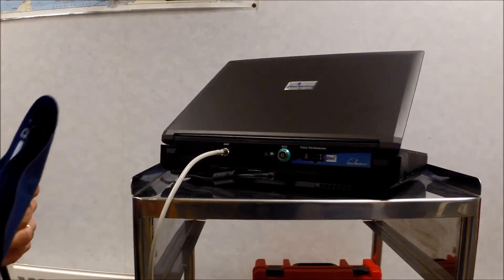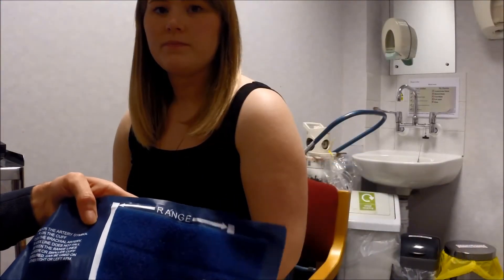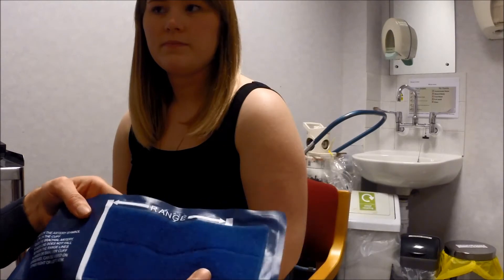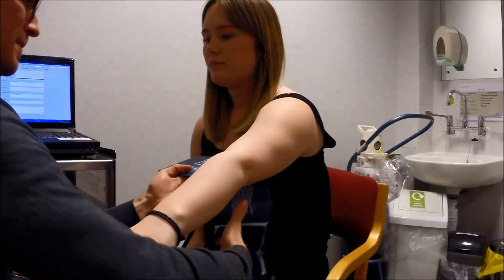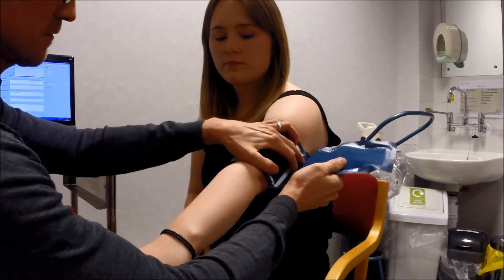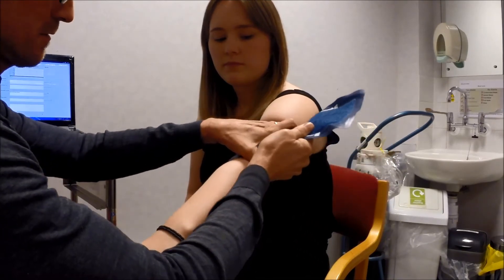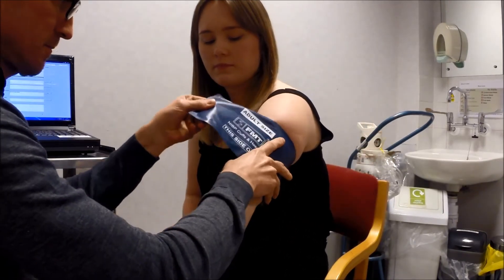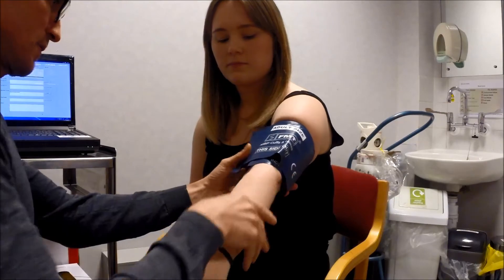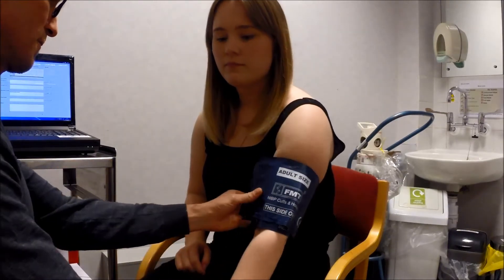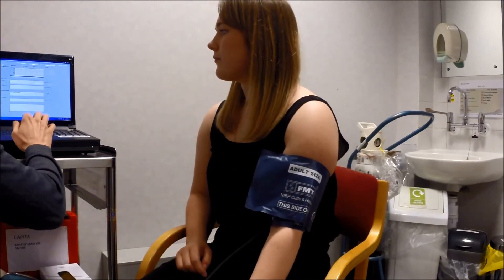Connect the hose to the NIBP outlet. Check the cuff is the right size for the patient you're testing and fix the cuff firmly around the patient's arm. Then encourage the patient to relax.